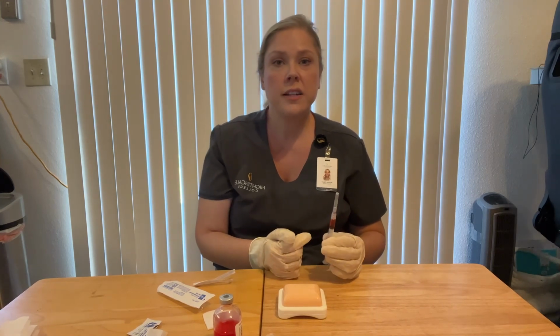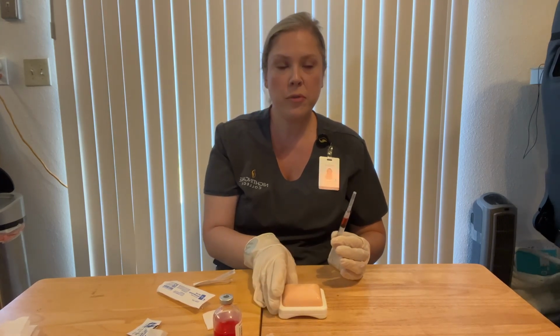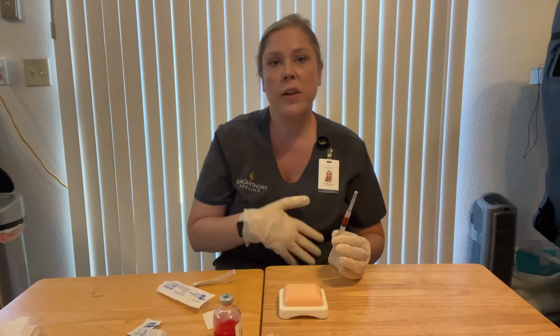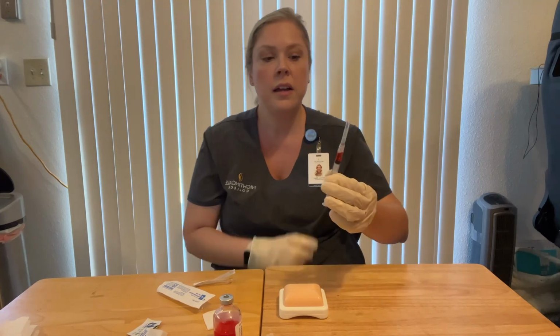We'd want to select our placement for our injection before injecting. So with a sub-Q, we'd either use the upper arm, the outer upper thigh, the abdomen, at least 2 inches away from the belly button, or the upper ventrogluteal area. And then here is my 1 mL of the heparin.